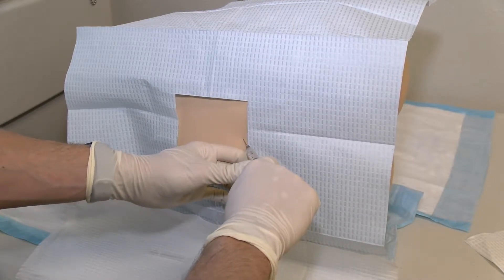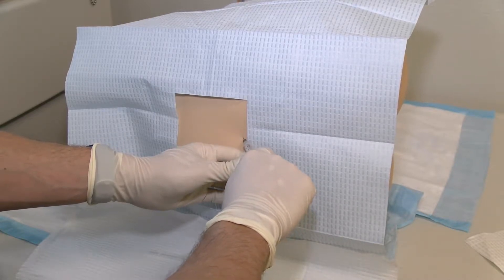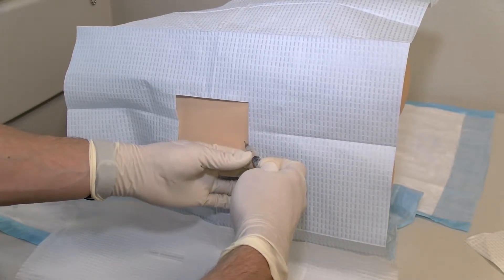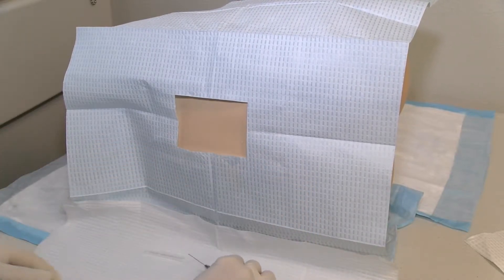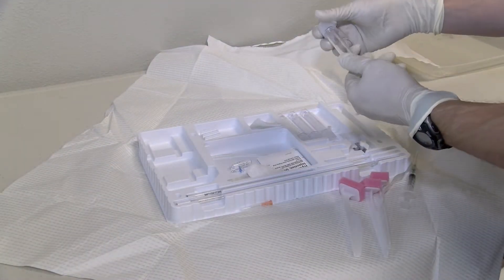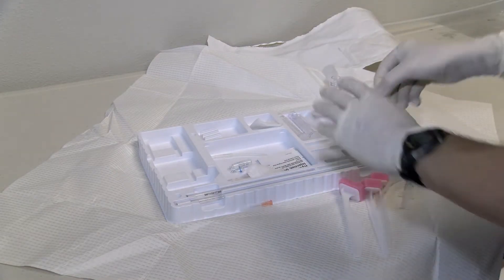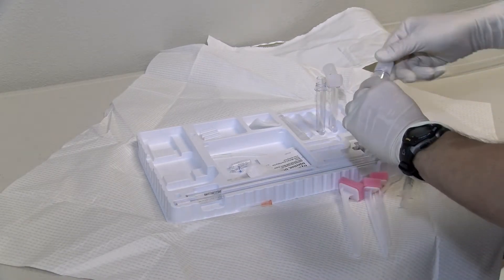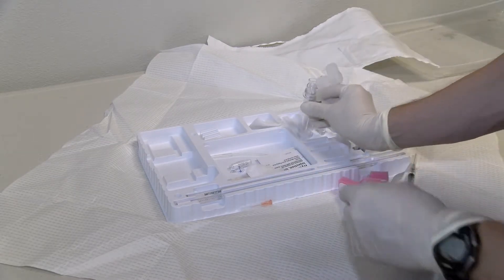Insert the needle containing lidocaine fully, providing slight negative pressure during insertion to ensure no vascular structure is encountered. Make sure you stop the needle just prior to entering the subarachnoid space. Once the planned depth has been reached, inject along the track as you withdraw. While the anesthetic takes effect, set up and open the fluid collection tubes from the kit, being sure to note the correct numerical order of the tubes to allow differentiation of cell counts between beginning and later tubes.